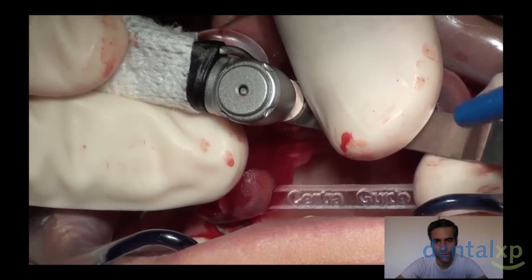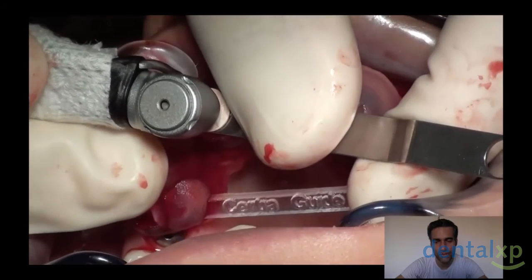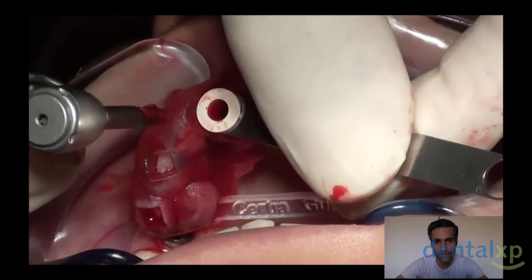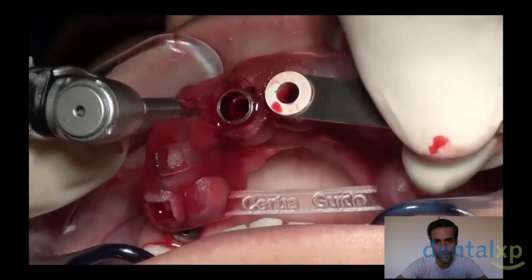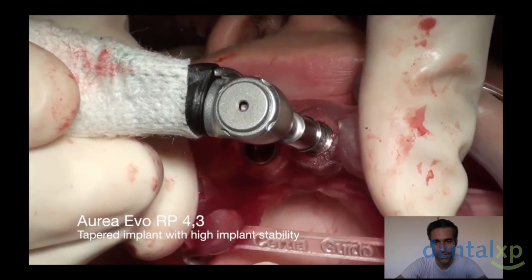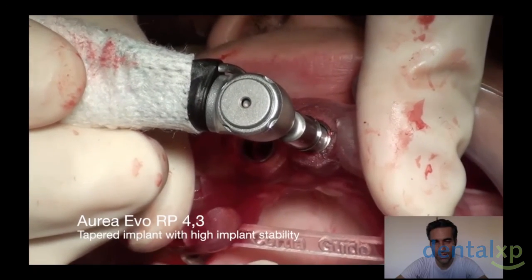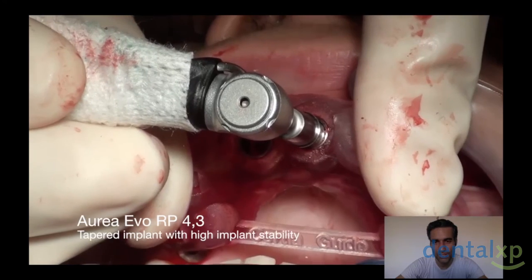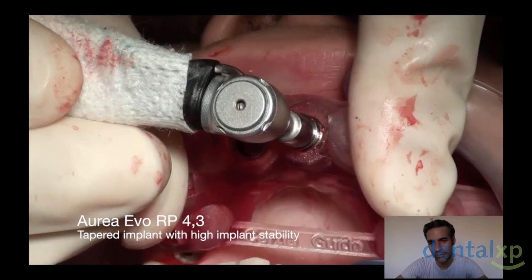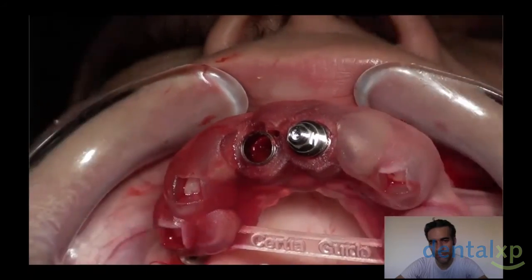Remember that we already have our provisional restorations manufactured before the surgery, with the connection, directly to the connection. Now the implants are going to be placed. As you can see, they have to match perfectly with the place where we planned it virtually.